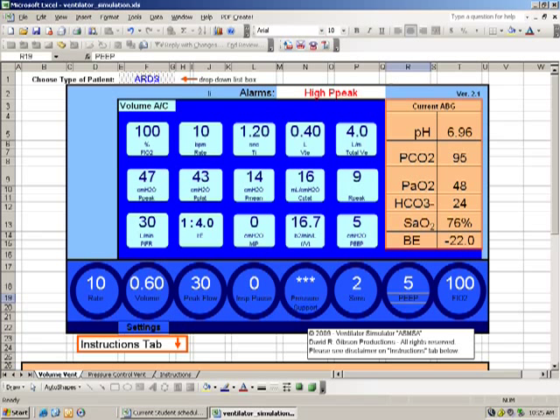By the way, I told them that the patient was 75 kilos and they chose something like eight times that for their volume, which the NBRC recommends 8 to 12. They had arbitrarily decided on a rate of 10, 5 of PEEP, and 100% since that's what the patient was on already.